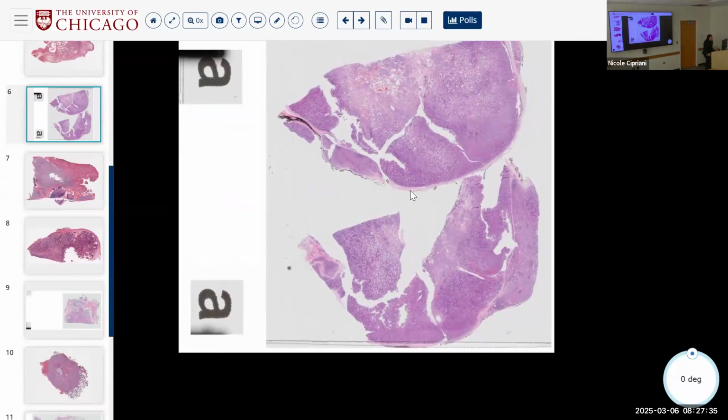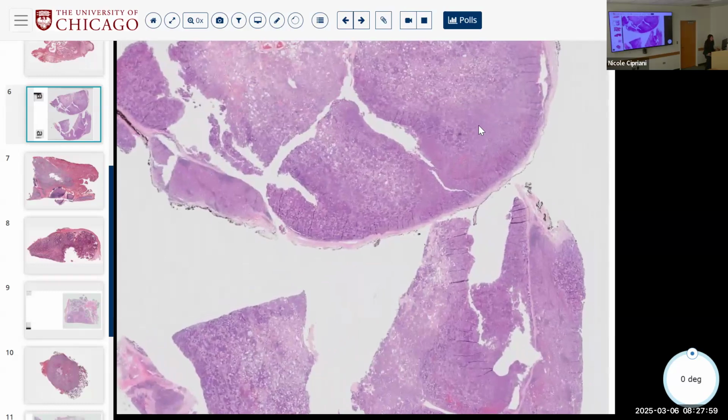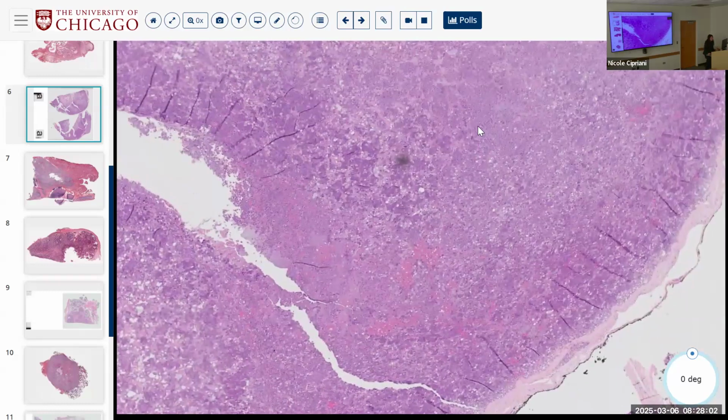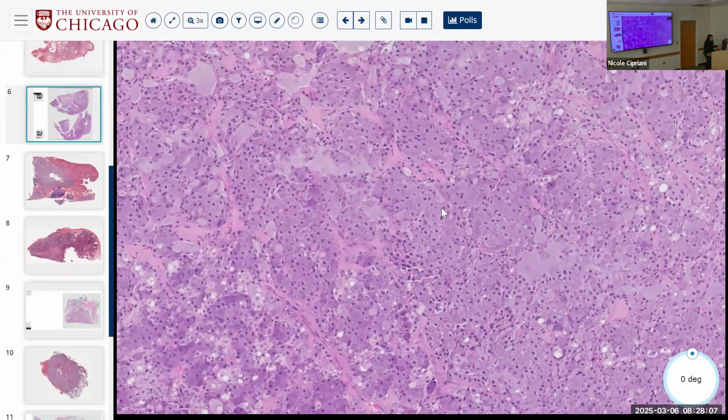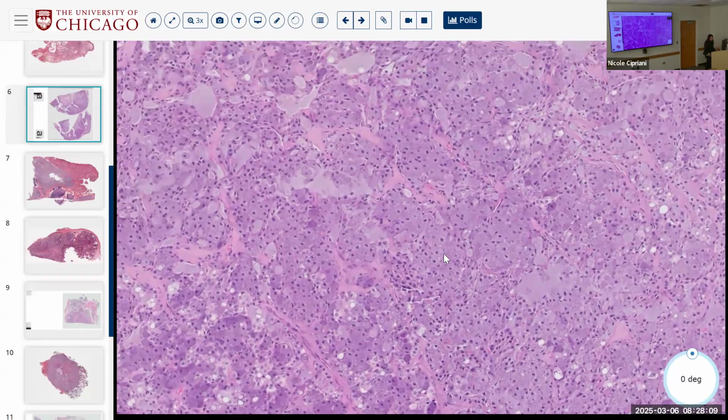Like when circumscribed, so as a capsule around, but I also see the tumor outside of the capsule. So I guess it has a specific pattern, so that maybe favors a malignant setting. Okay. This is just low power. Yeah. And at higher power, these cells remind me of the cells that are in the acini, but in a more disorganized fashion.